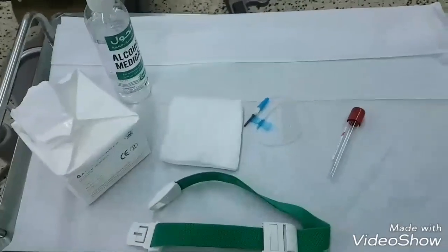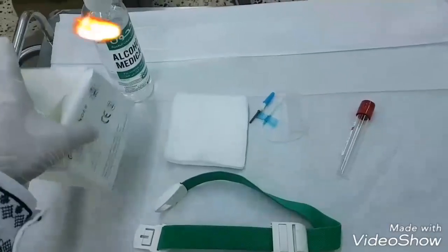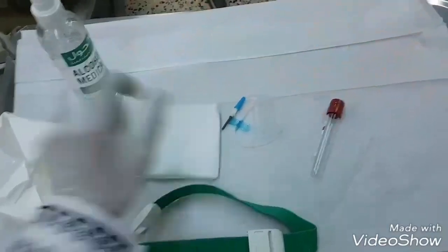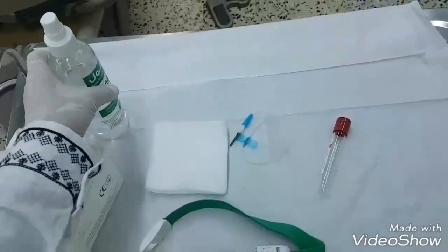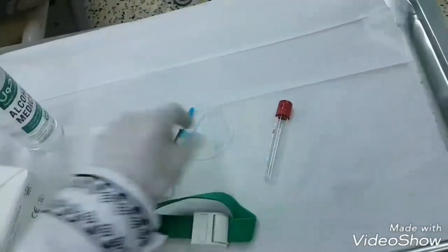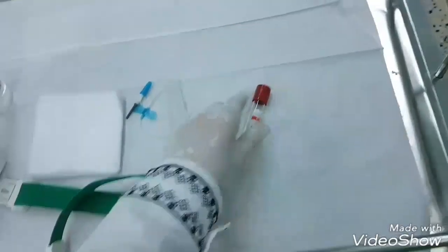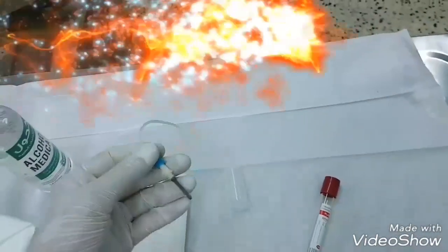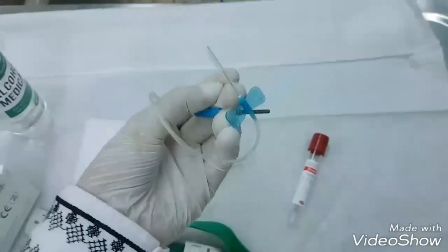These are the instruments needed for platelet-rich fibrin preparation. First, we have gauze. We need alcohol for sterilization of the patient's arm. We also need a tourniquet. We have a vacuumed glass tube, and a butterfly needle — a vacuumed butterfly needle.